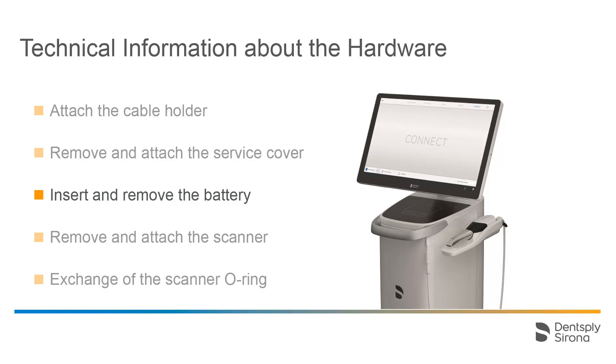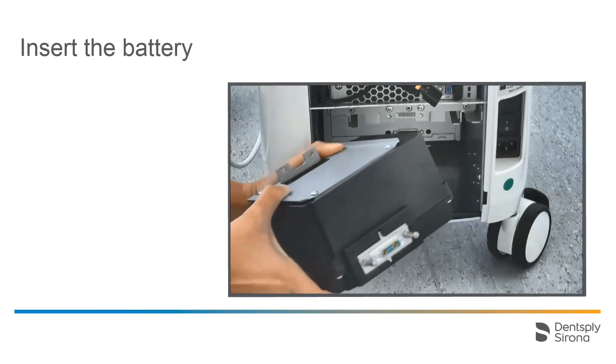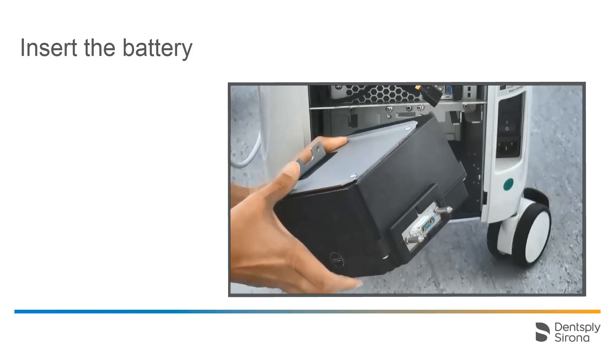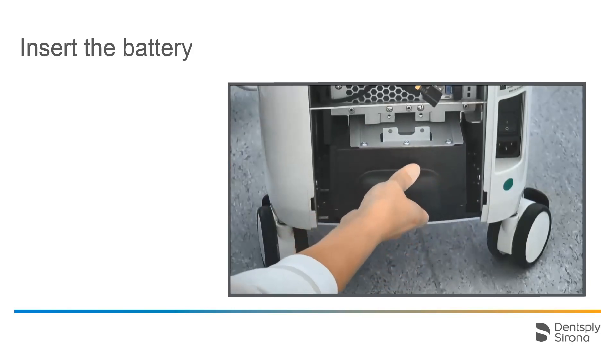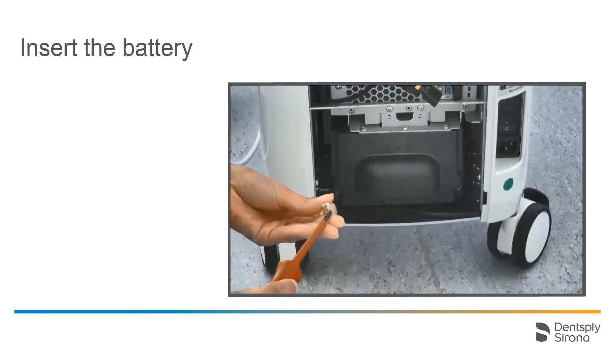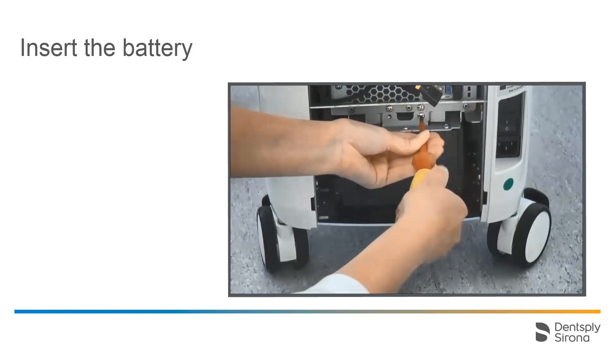The battery can be inserted and removed in just a few steps. First of all, remove the service cover. The battery is placed into the lower part of the Acquisition Center. Remove the two marked screws — they will be needed later to fasten the battery. There are two guide rails inside the casing as well as two holes for guide pins for the final and secure placement of the battery. The battery also has guide rails as well as two guide pins which are used to place the battery in its final position. The two screws are used for fastening the battery inside the casing. Afterwards, the service cover is reattached and the battery is fully functional. No settings need to be adjusted.